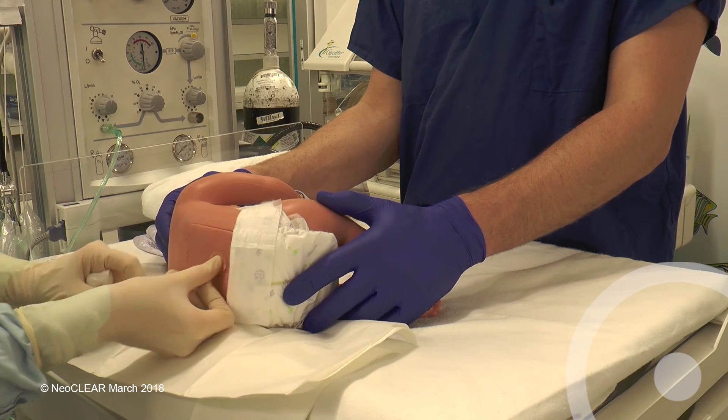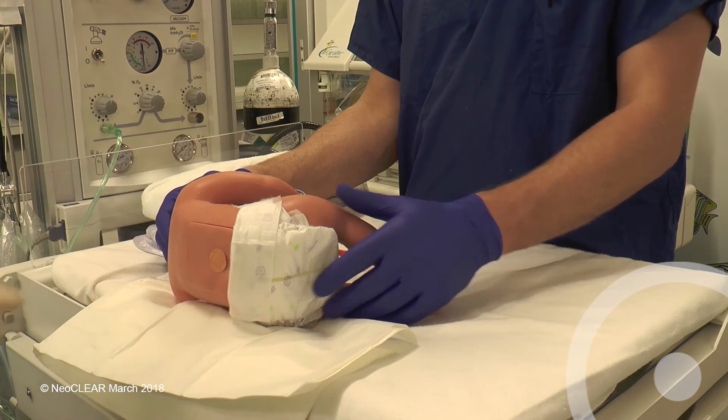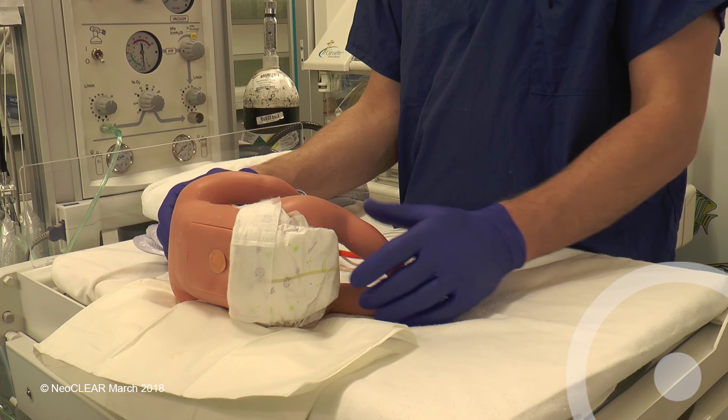After disposing of sharps and clinical waste, complete the case report form and update the parents.